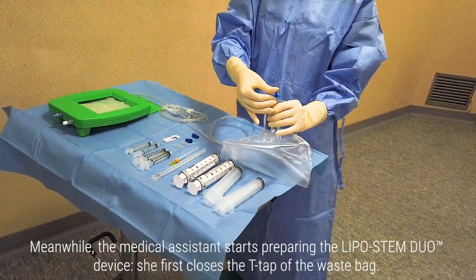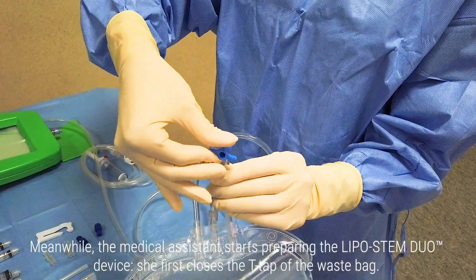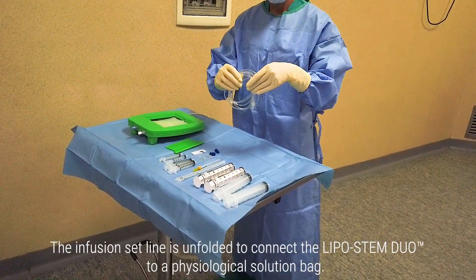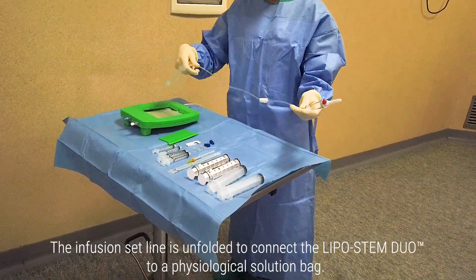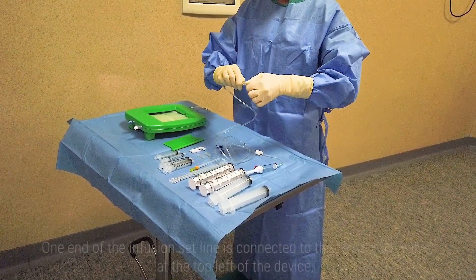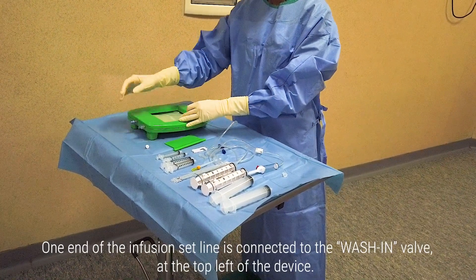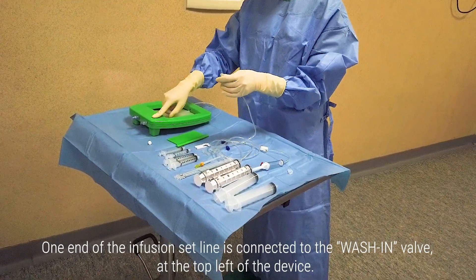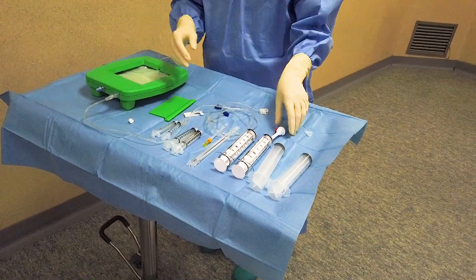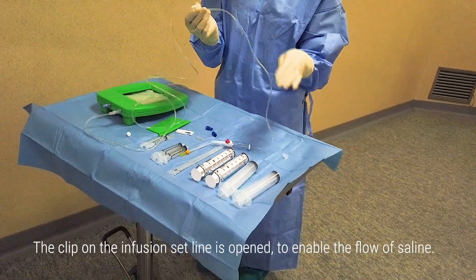Meanwhile, the medical assistant starts preparing the Lipostem Duo device. She first closes the T-tap of the waste bag. The infusion set line is unfolded to connect the Lipostem Duo to a physiological solution bag. One end of the infusion set line is connected to the washing valve at the top left of the device, and the clip on the infusion set line is opened to enable the flow of saline.